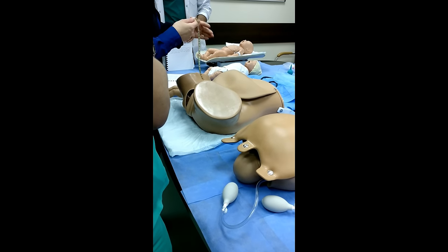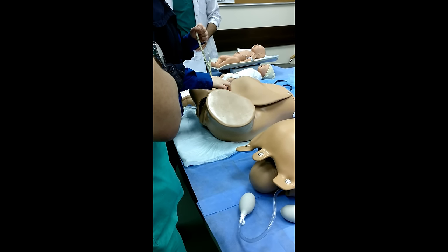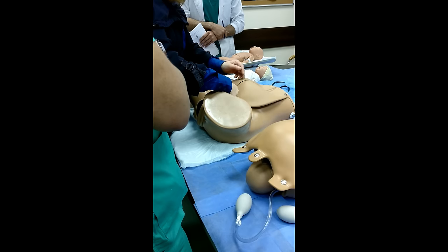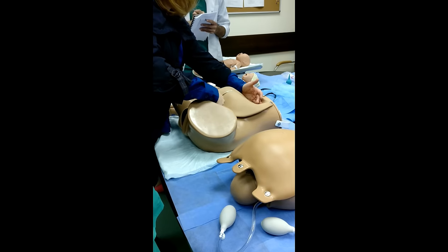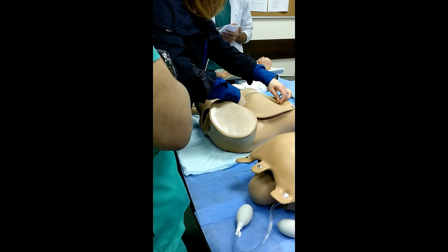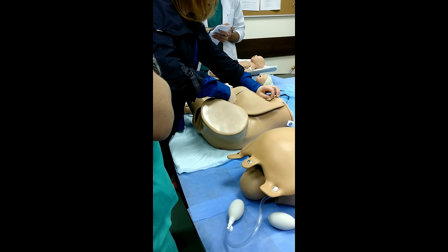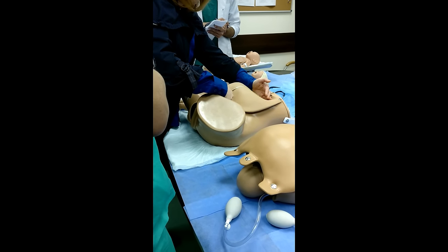To measure the fundal height, we use a tape. We palpate the symphysis. We apply the tip of the tape on the symphysis, and we adapt it to the uterus up to the highest point of the fundus of the uterus, and we measure the fundal height. What's the number? Here the number is about 24 centimeters.